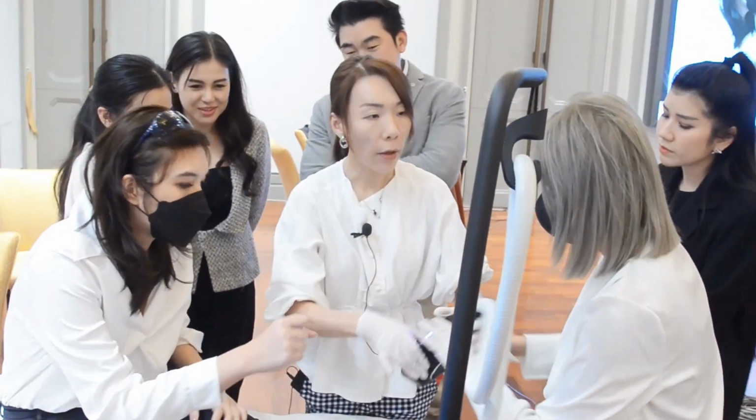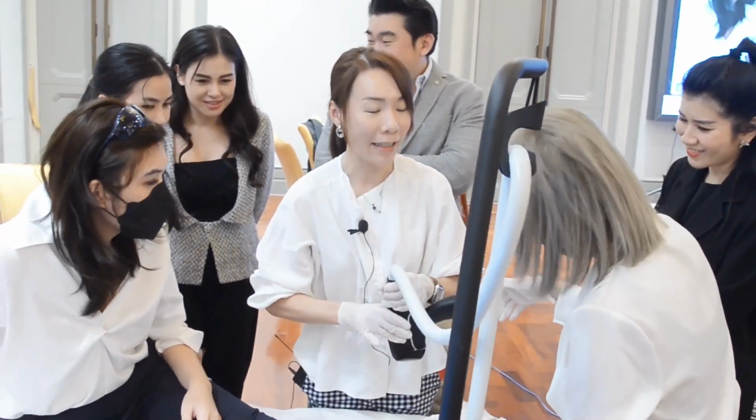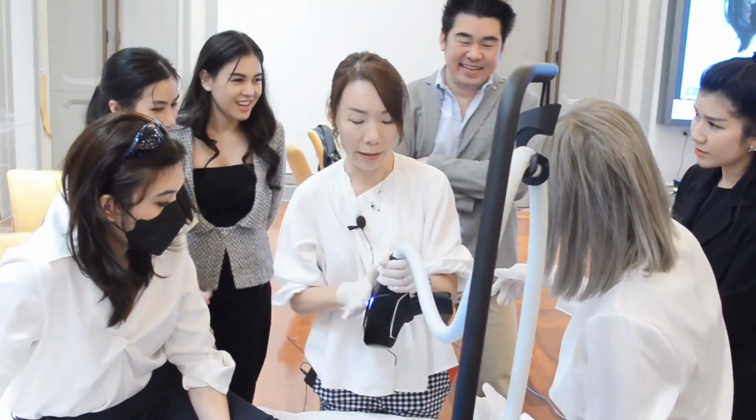Okay, because this is a laser, you do not point the handpiece on people.